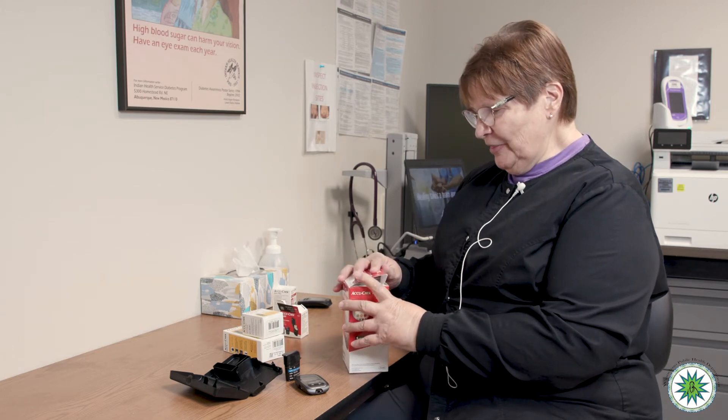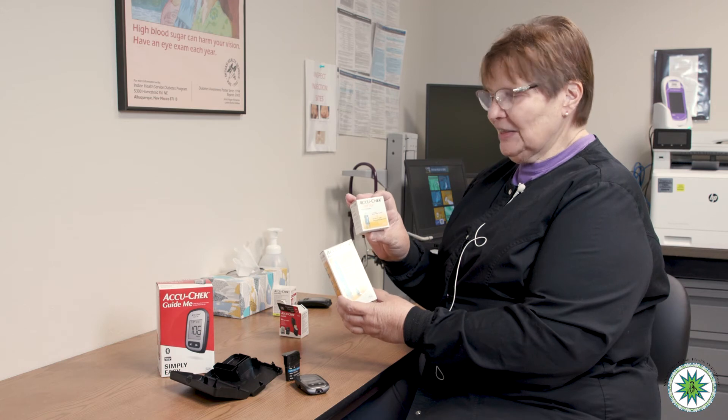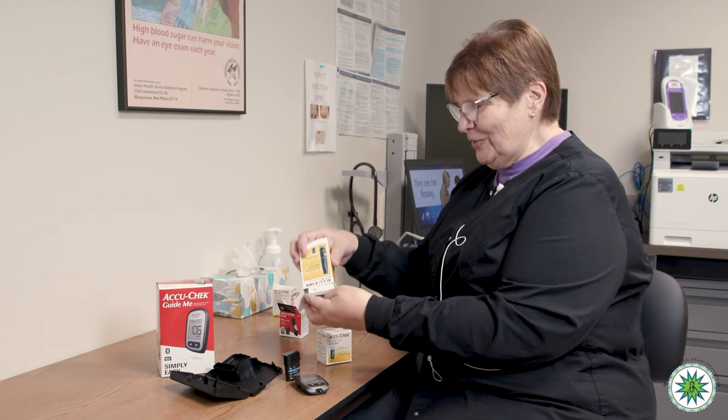The final thing I want to show you is something many of you have been using — the system to prick your finger to get a drop of blood. That's all exactly the same; nothing has changed with the AccuCheck FastClick lancing device and the AccuCheck FastClick lancets you've had in the past. But since I have the chance, I'm going to show you that quickly.